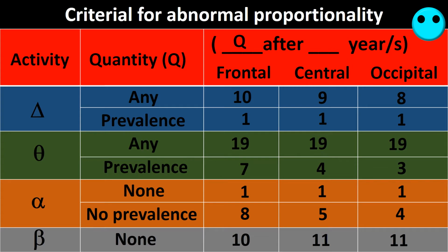It is important to stress that these parameters are the conclusion of one individual based on my interpretation of a figure that was drawn from information presented in a paper written in 1949. So, contradictory conclusions could have been drawn at many steps along the road. I will point out some of them in the next few frames.